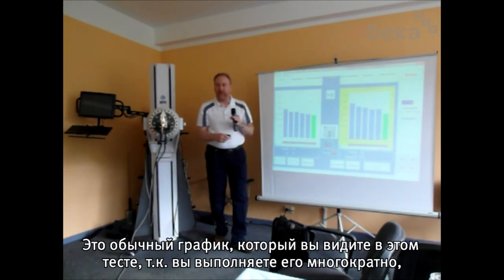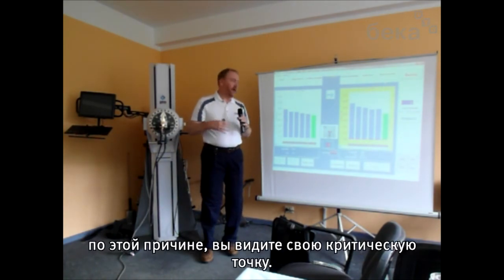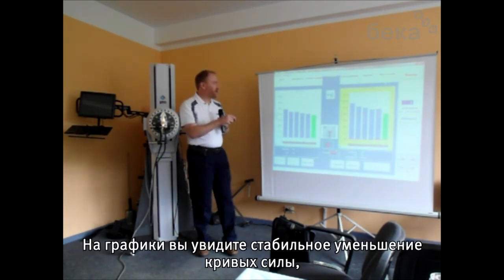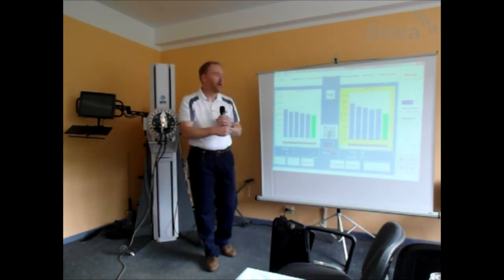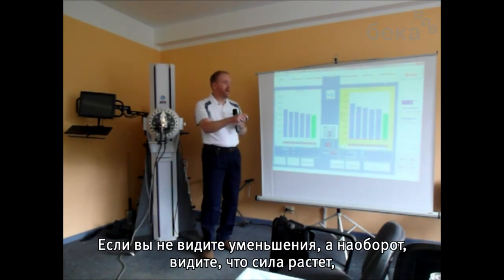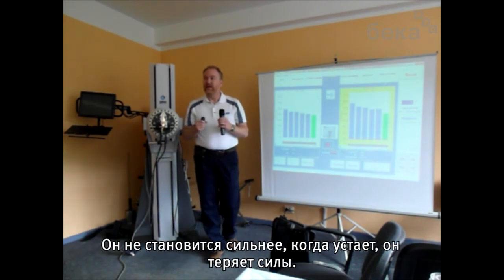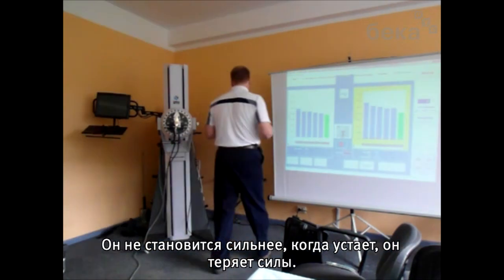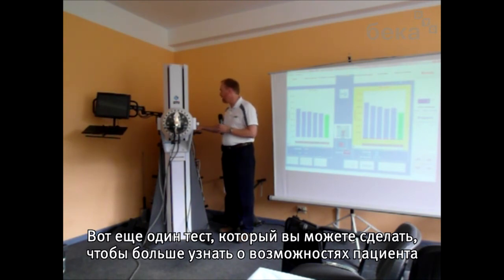So the typical pattern that you see for this test, because you're doing it multiple times, and for that reason you're introducing fatigue into the test. So the expectation is you should see a slight decline in force as you progress through each of the trials. If you don't see a decline, or if you see an increase, that's an indication that they're probably not squeezing as hard as they can, because you don't get stronger when you get tired, you become weaker. So that's another consistency of effort type test you can do to develop your profile or pattern of behavior for the individual.